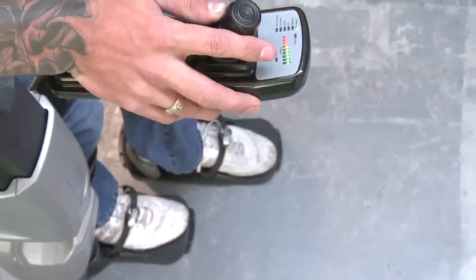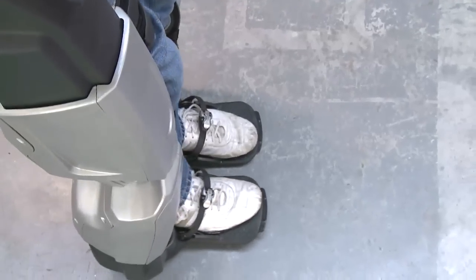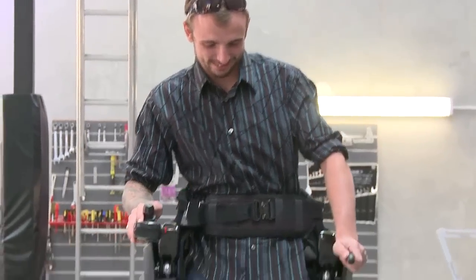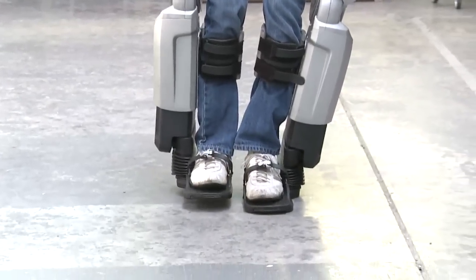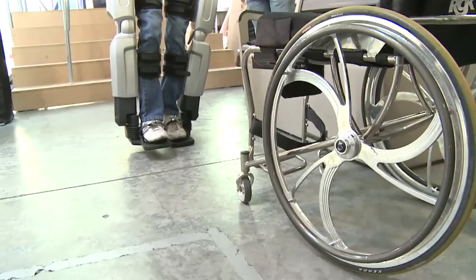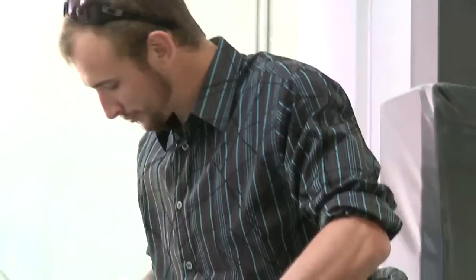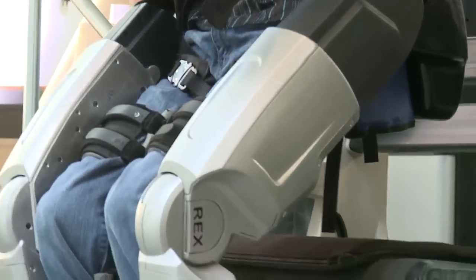Everyone was trying to tell me to look in the mirror and watch the movement to get familiar with it, but I just couldn't look up — I spent the whole time looking at my legs moving. It just blew me away. I told the doctors after my accident that I was going to walk again; I didn't realize I was going to walk in a robot, but this is just blowing me away — being able to watch one foot in front of the other. You just couldn't ask for a better feeling.